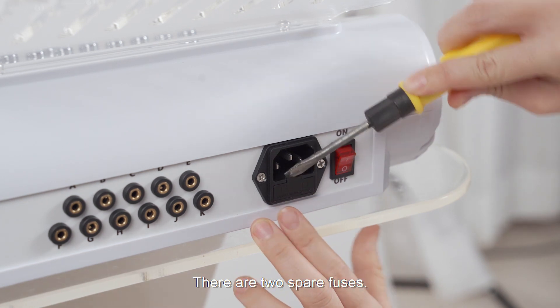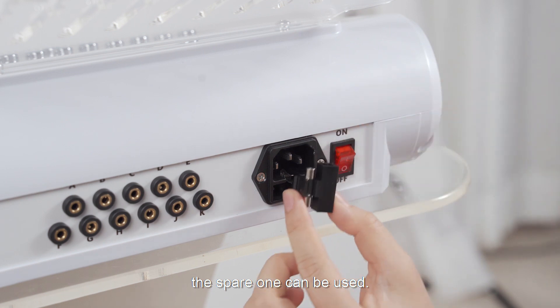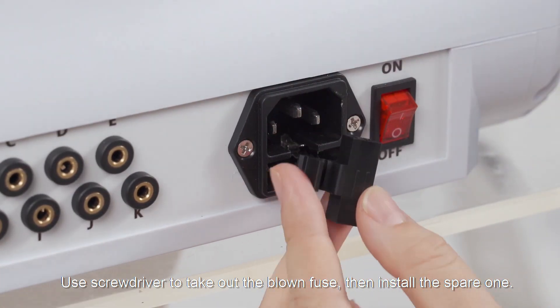There are two spare fuses. When the fuse inside the machine is blown, the spare one can be used. Use a screwdriver to take out the blown fuse and then install the spare one.